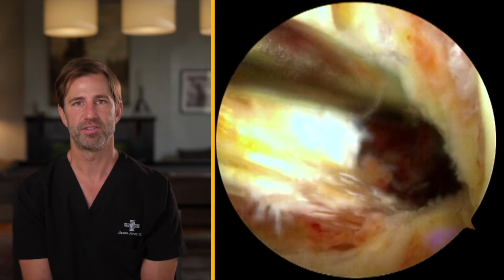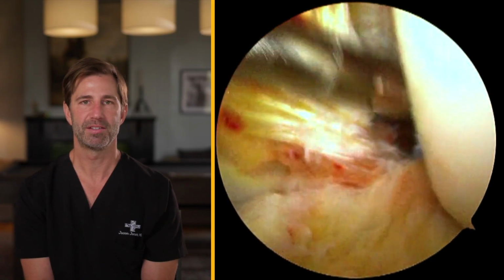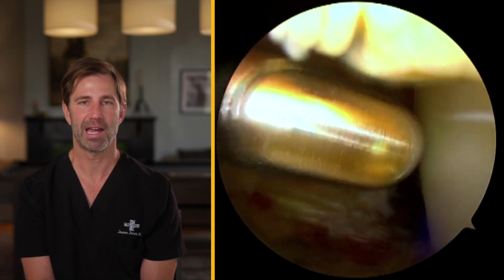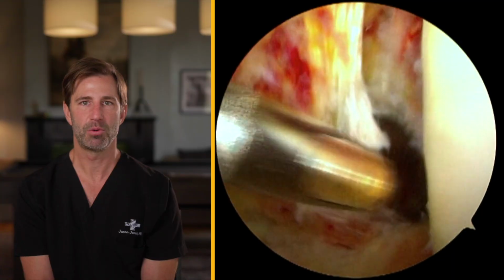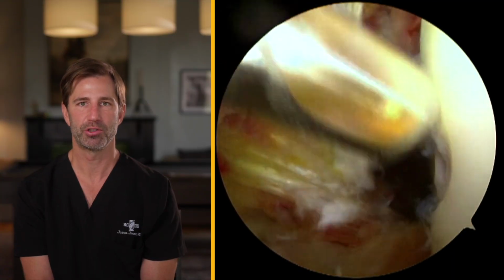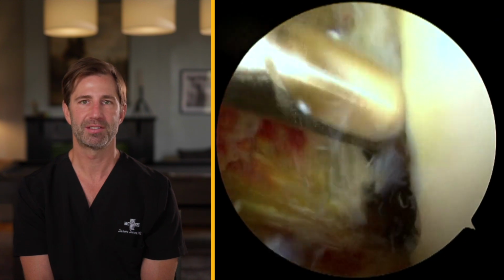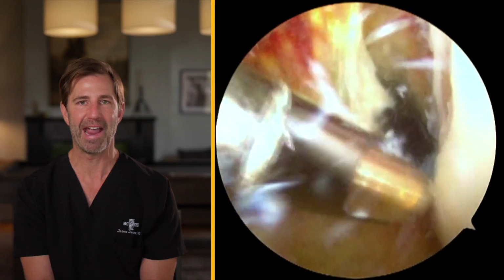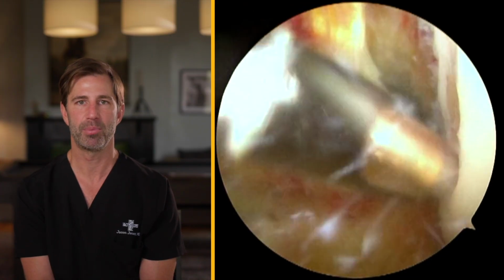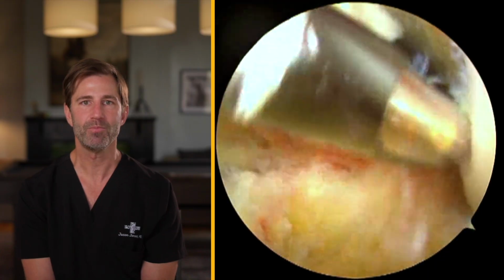In this particular case, we've decided to proceed to a bone-tendon-bone type of reconstruction. What that means is that we'll take the center portion of the kneecap itself, and then we'll take the tendon which attaches to the inferior portion, and then also a small piece of the bony attachment called the tibial tubercle. We'll use this as a new ACL. The two bony portions of this tendon are used as anchor points. One will be anchored in the top bone or the femur, the other will be anchored in the tibia below.